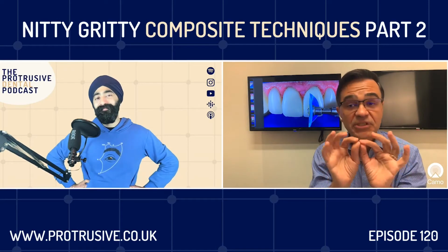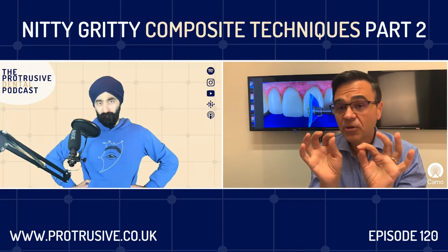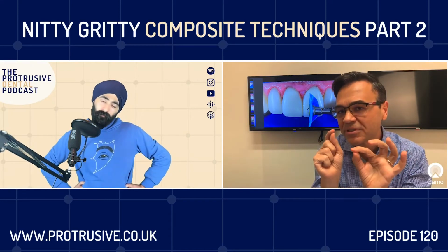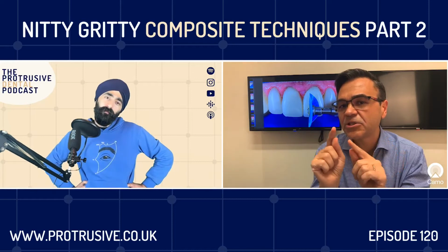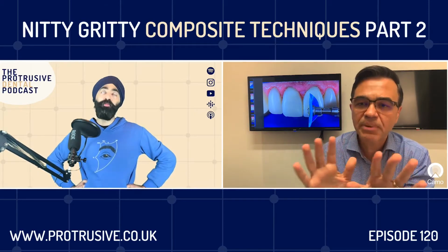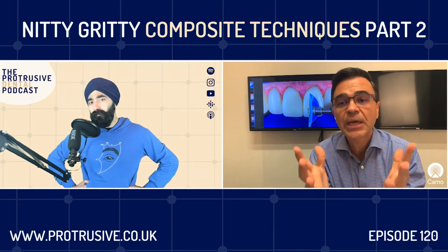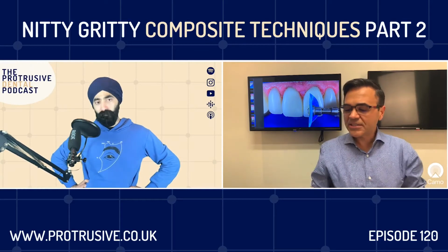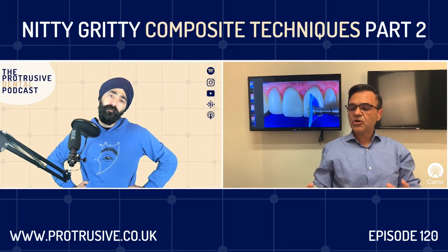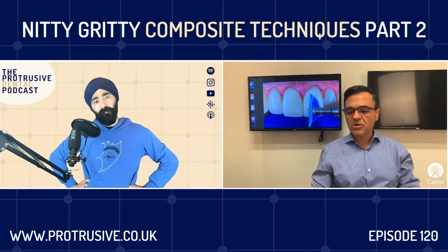And at that moment, if you see a little spot, like a little hole, or sometimes you see a piece of dust, then you go ahead and take a diamond, take it out, put some bonding resin. Do not cure the bonding resin, and put some more composite on top of it, and then finish polishing it, because you don't want to have those mistakes showing up at the end. Okay, this is the last step of finishing. It's called finishing because you're making sure that you have the right anatomy and the right texture.